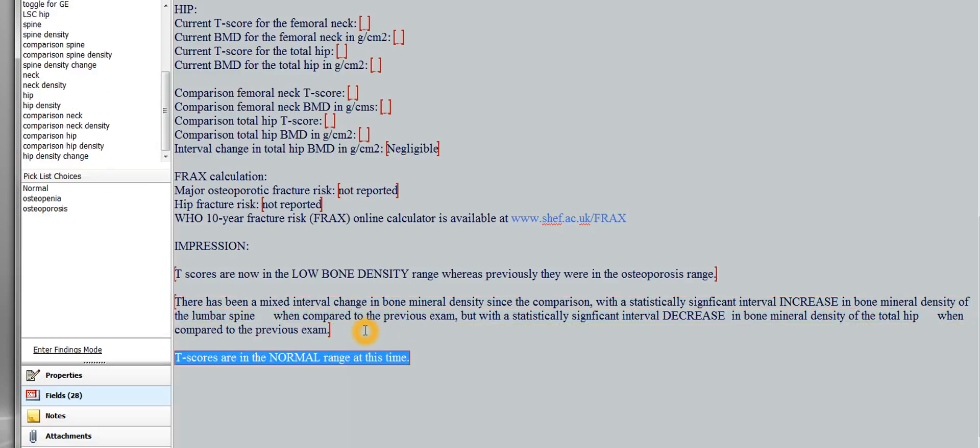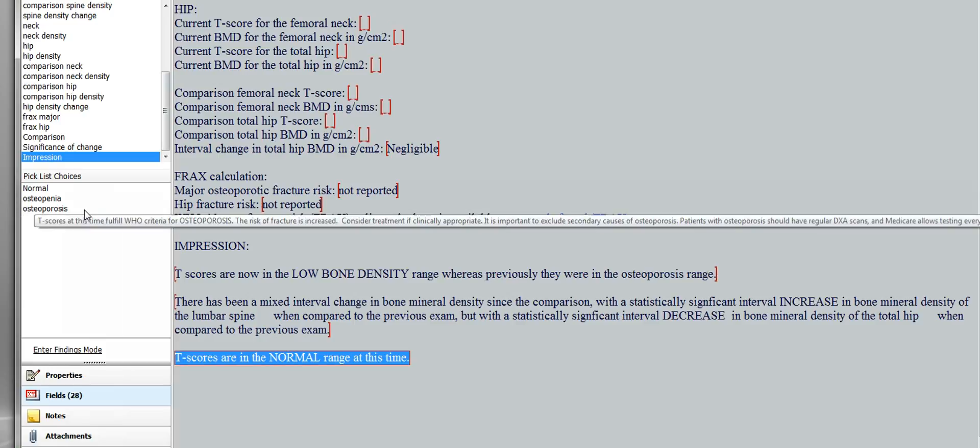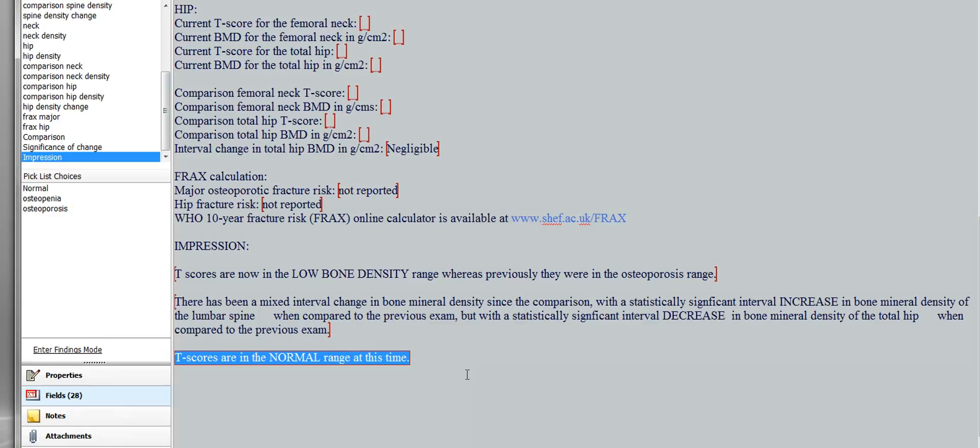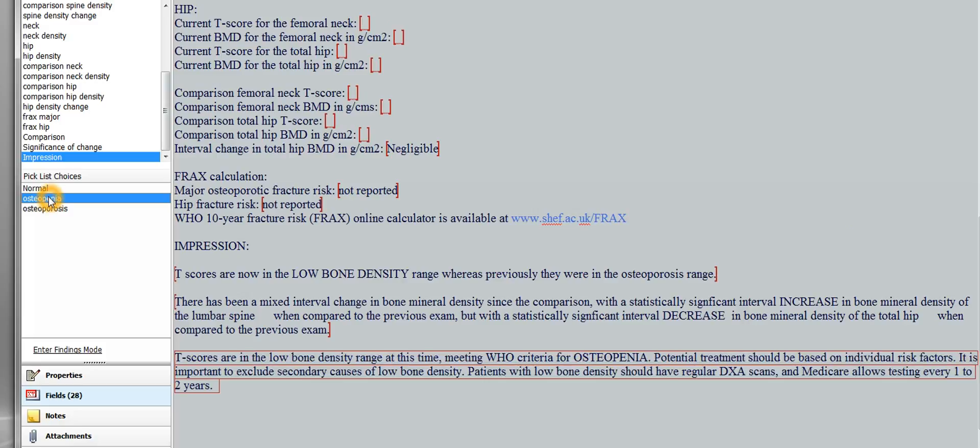It's like, what does that patient have, and what do they need? And the various societies recommend that you give certain statements about secondary bone density, and recommend the mechanizations for follow-up, and to consider treatment for patients who have osteopenia, osteoporosis, so we need to put that in somewhere. So this is the sort of current state of affair for the patient at this time. So if they're normal, they just get T-scores are in the normal range. If they're osteopenia, you click that one.